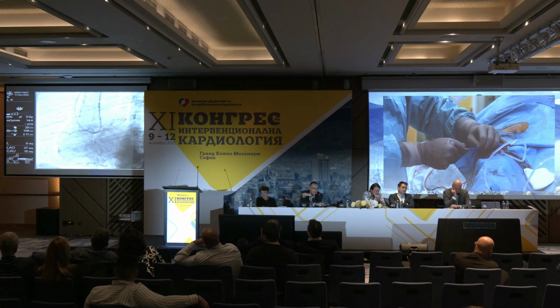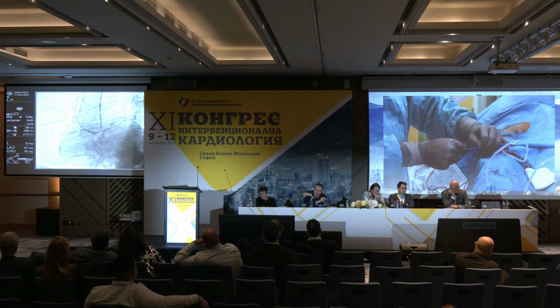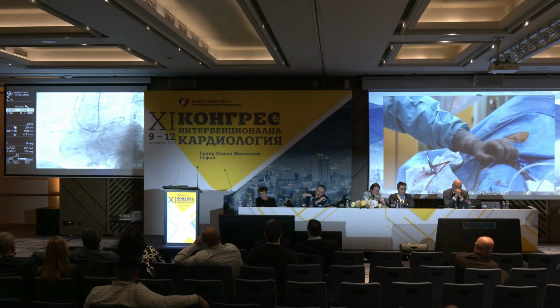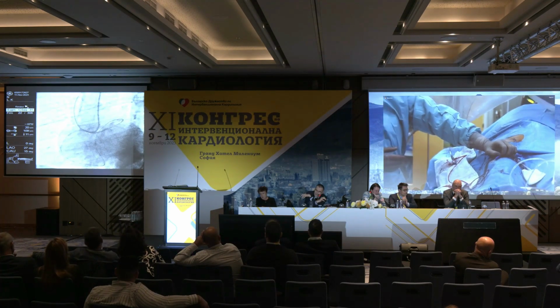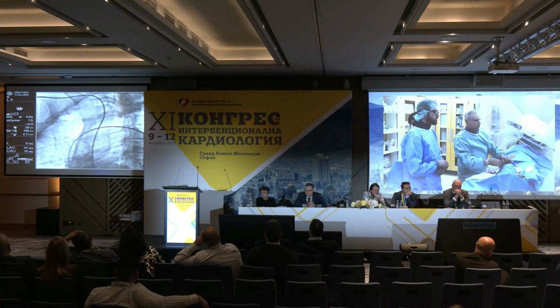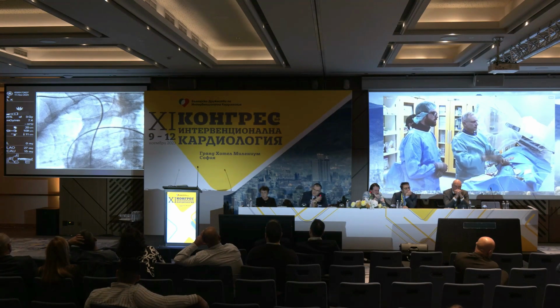So, yeah. Your Gladius is somewhere in subclavia. Yeah, but I mean, I crossed now, save that. No, I know, just because I missed the, yeah. No, simply the wire over there. Yeah, you see that okay. When I was pushing the wire, it was going there in the aortic carotid.